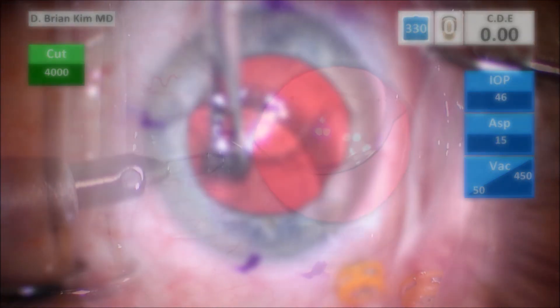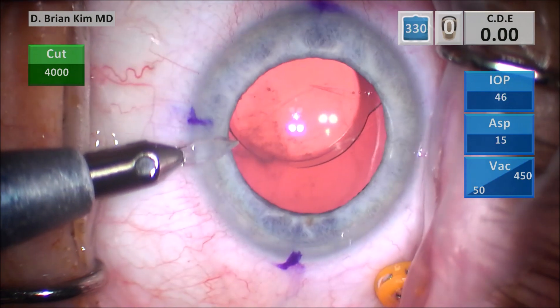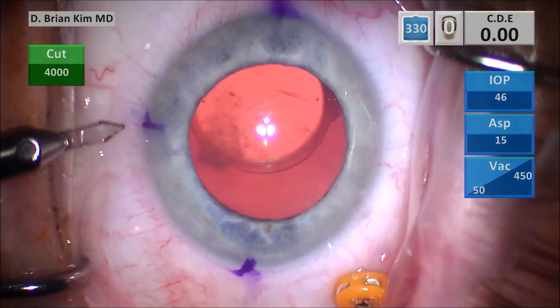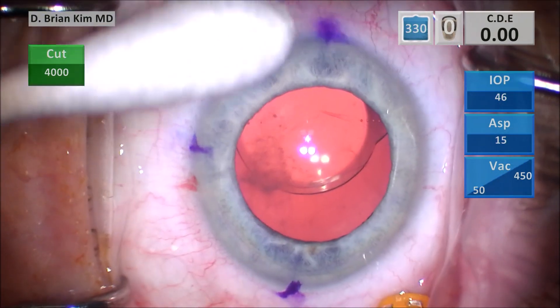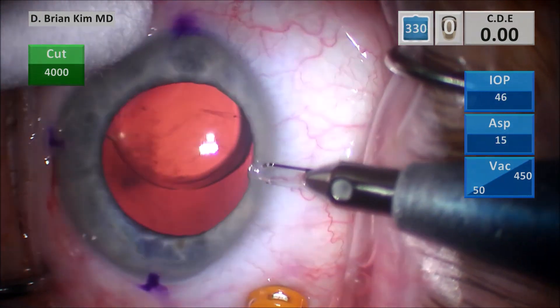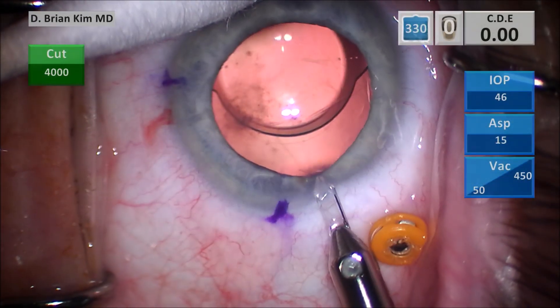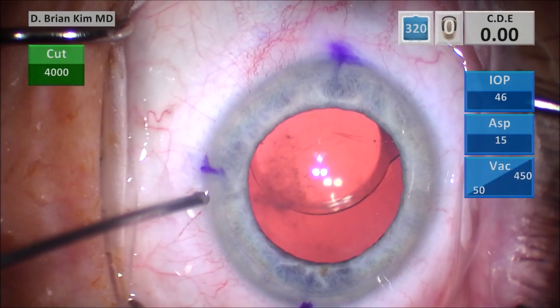I'm going to make my paracentesis incisions. I'm going to have to widen the incisions because I'm going to be using a 23-gauge anterior chamber infusion cannula, as well as my vitrector which is about 23-gauge, so I need to make sure I make those incisions a little bit wider than normal. I'm making three paracentesis incisions, and I'm hoping that I can reposition this lens rather than explanting it.